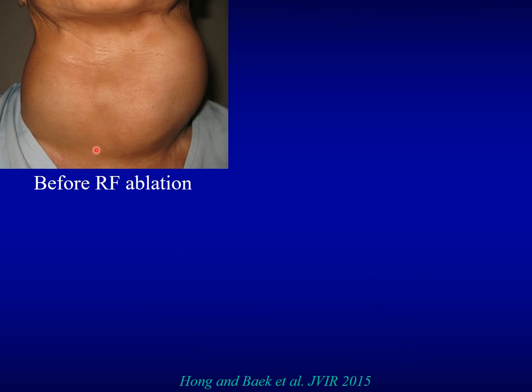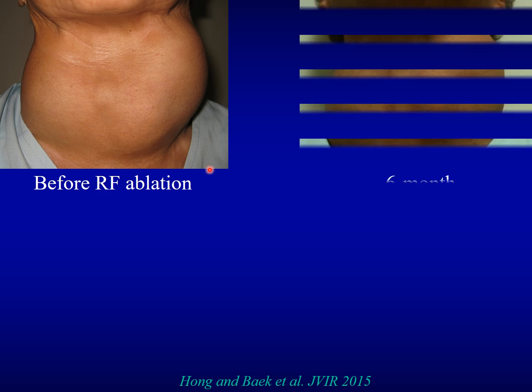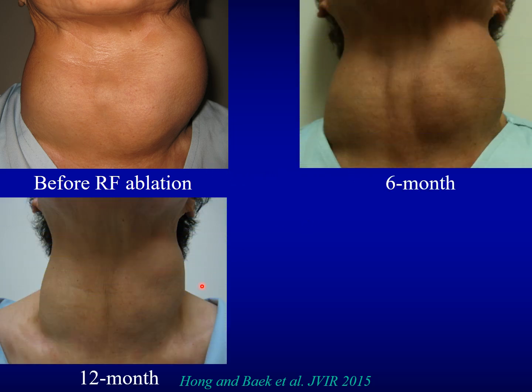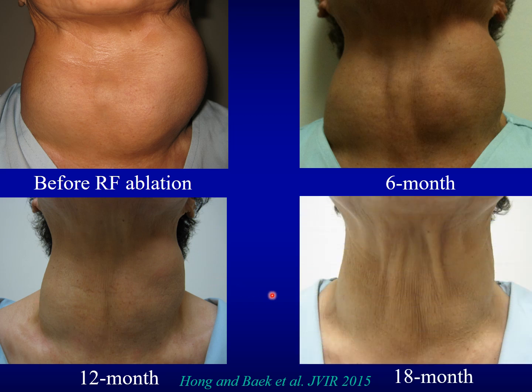The neck bulging is usually well controlled by radiofrequency ablation. 6 months, 1 year, and 1.5 years. The markedly bulging neck was nearly normalized.